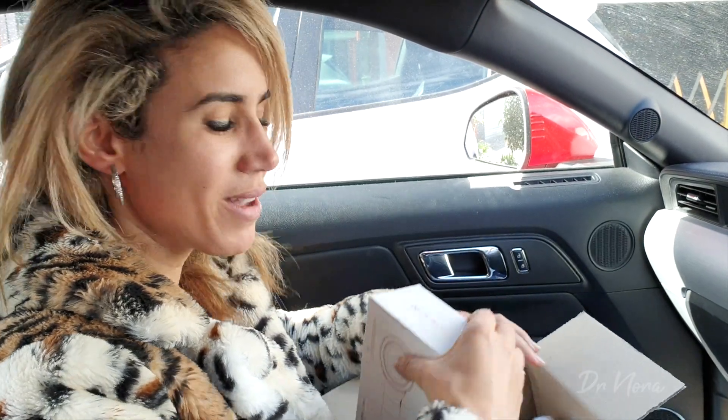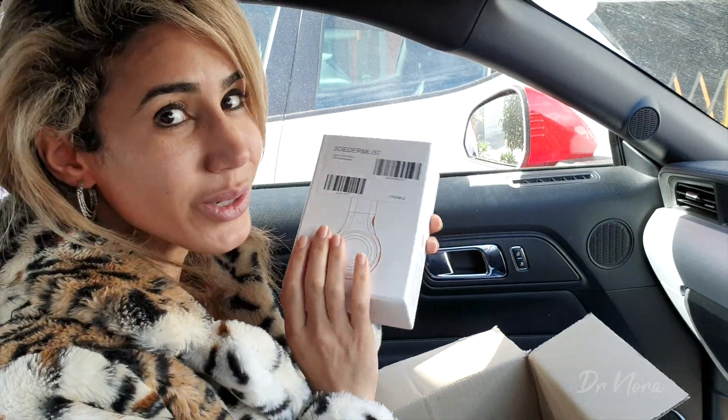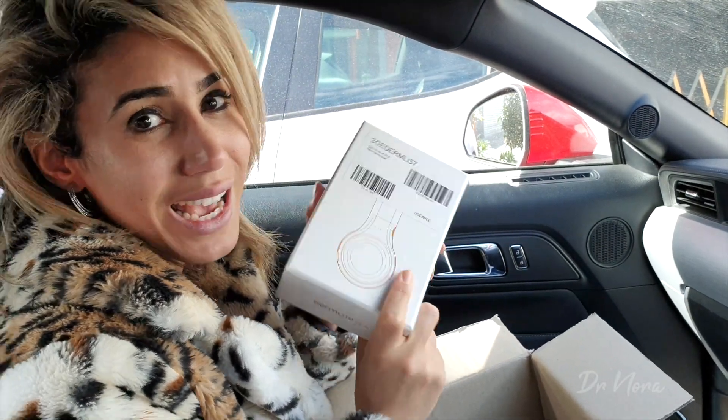Now it's time to head on home and I'm going to unbox this baby in front of you guys and let you know exactly what we do as general practitioners to use this and what it's useful for.